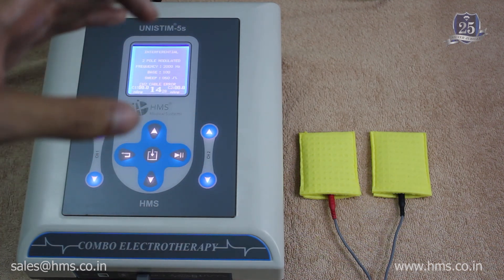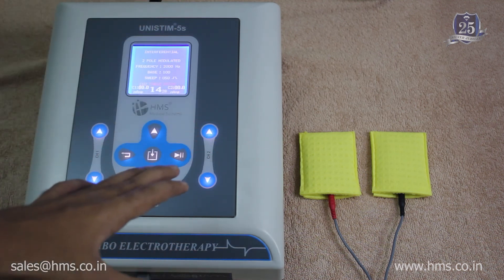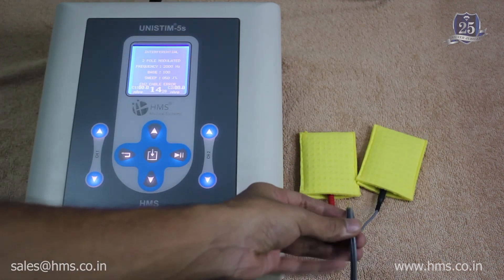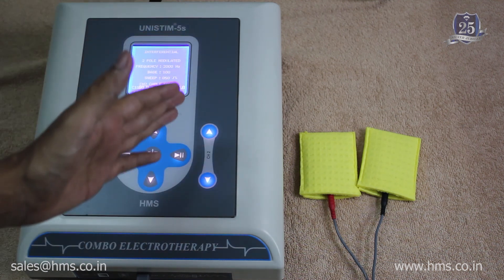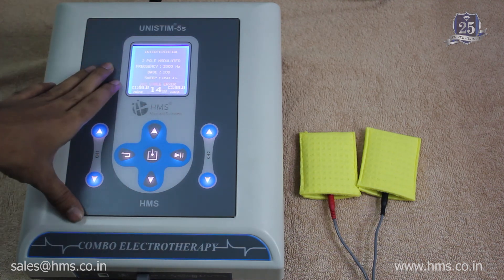This is a state-of-the-art safety feature available with all HMS product lines. Always use genuine HMS product accessories, as only then will this feature work perfectly and deliver the right treatment results.